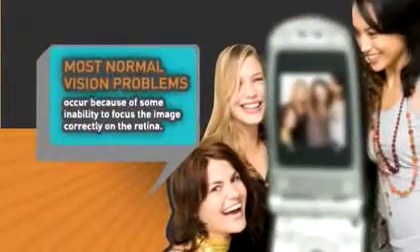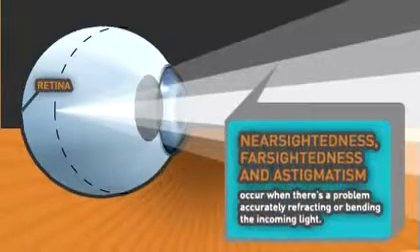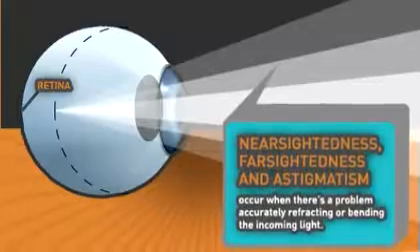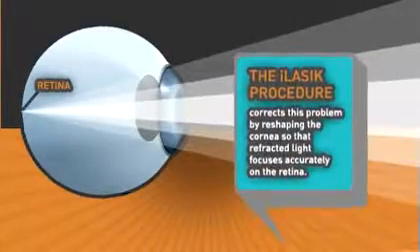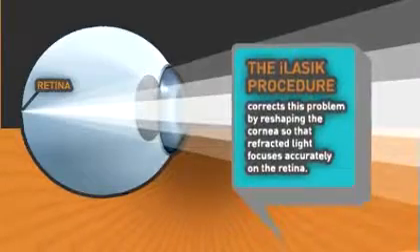Most normal vision problems occur because of some inability to focus the image on the retina. Nearsightedness, farsightedness, and astigmatism occur when there's a problem accurately refracting or bending the incoming light. The iLASIK procedure corrects this problem by reshaping the cornea so that refracted light focuses accurately on the retina.